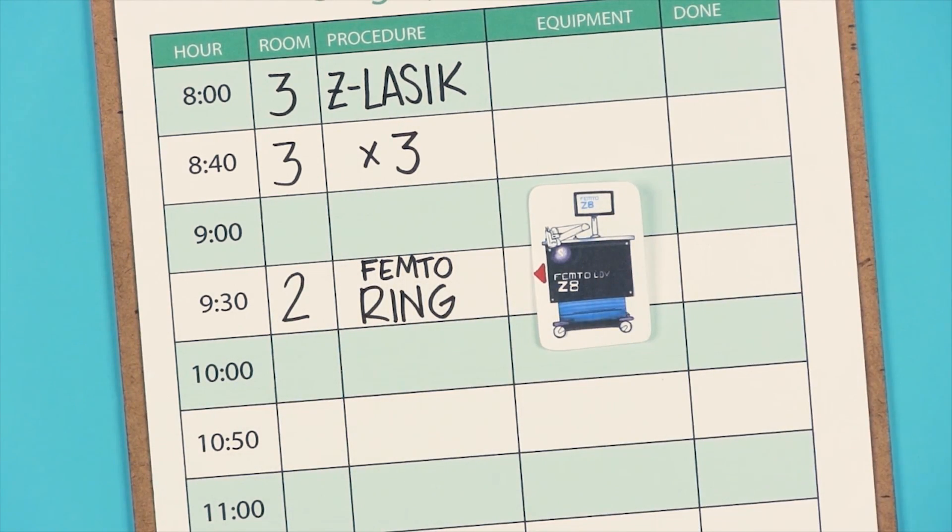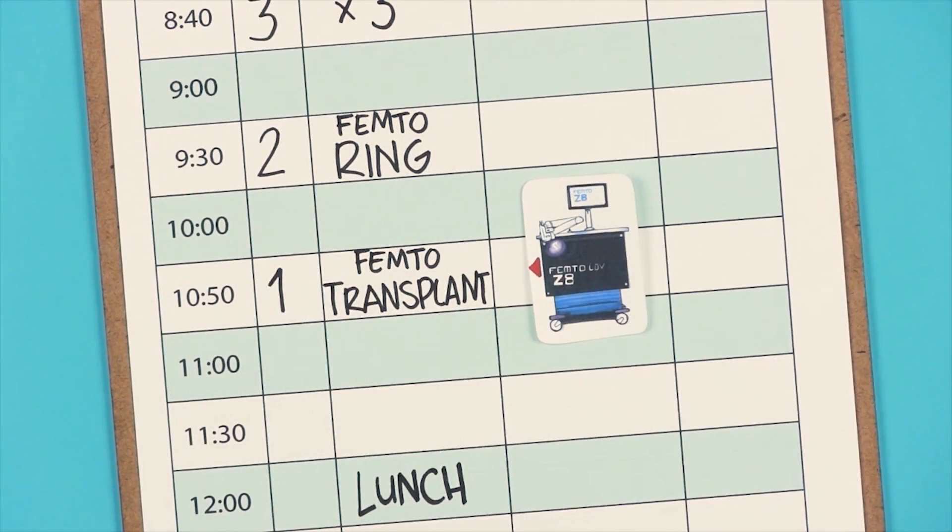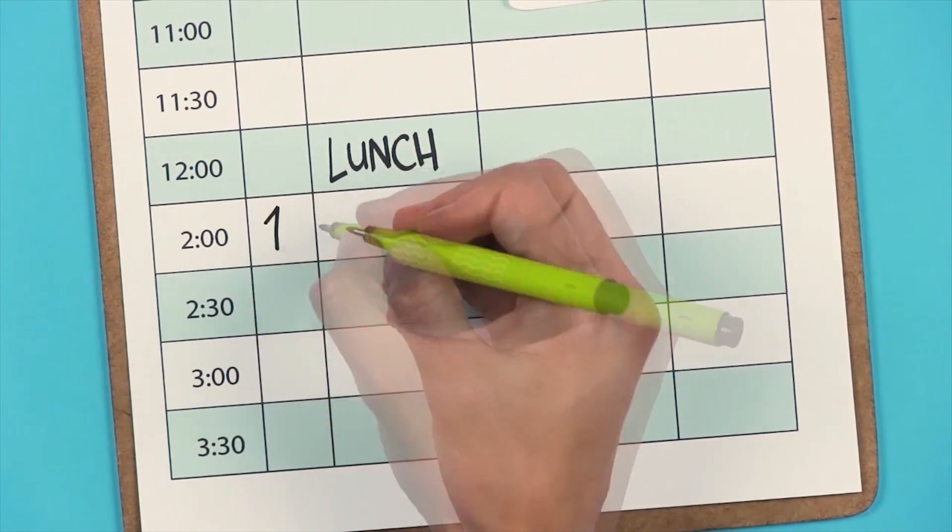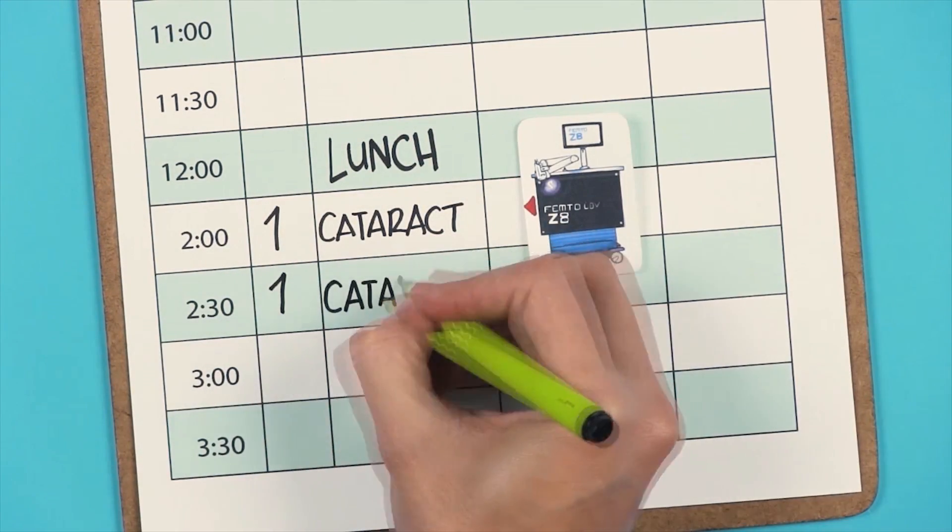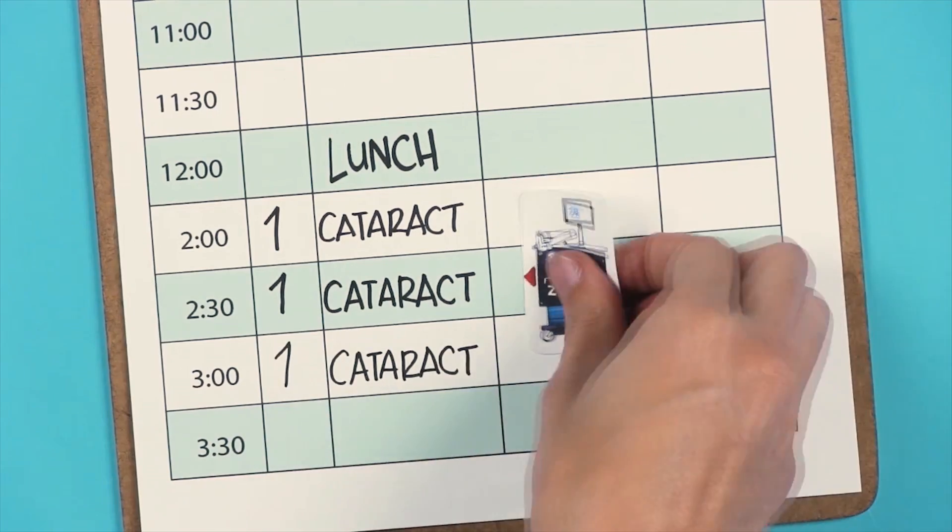At room 2, we can do a corneal ring at 9:30 and a corneal transplant at 10:50. Finally, starting at 2 p.m., we perform three Femto cataract procedures at room 1.